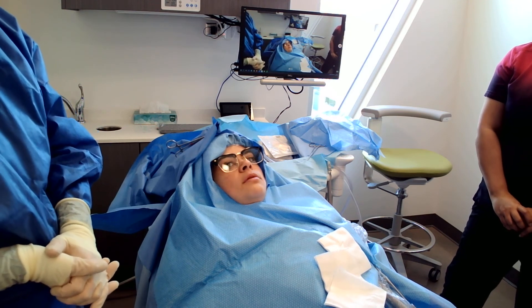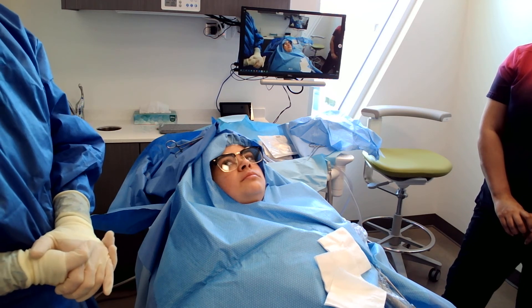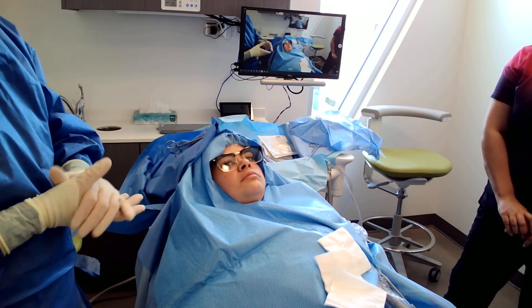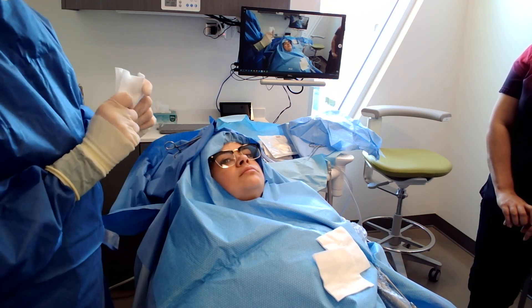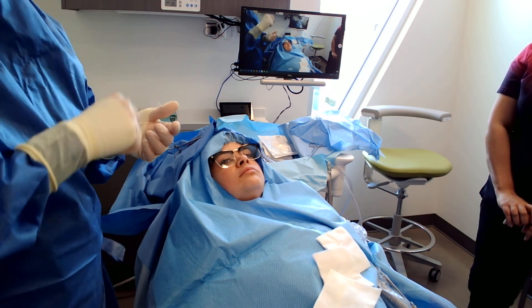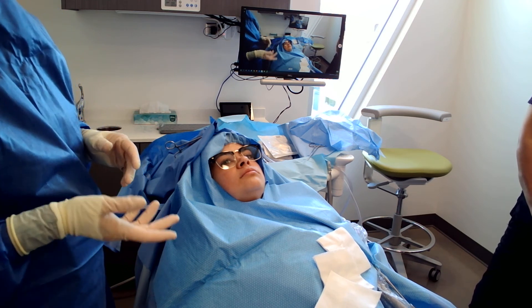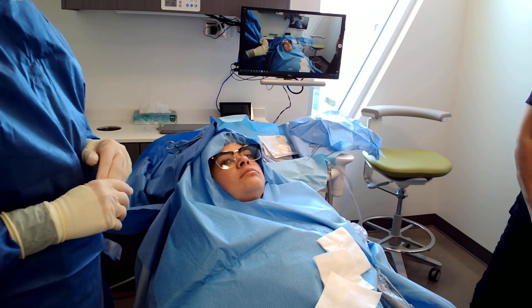Where does all the garbage go? Usually if it's a surgical case, there's lots of bloody gauze, so I'll change the garbage before I bring the next patient in. Now with COVID, we take the garbage out after every single surgery — we don't leave someone's bloody gauze when we bring another patient in. I will count my gauze. I'll know that I had ten 4x4s and six 2x2s, because at the end of the procedure I want to make sure I didn't leave a throat pack in. Sometimes if a dentist elevates a big flap, he'll leave a little 2x2 tucked in while he grabs bone from, say, the maxillary tuberosity.